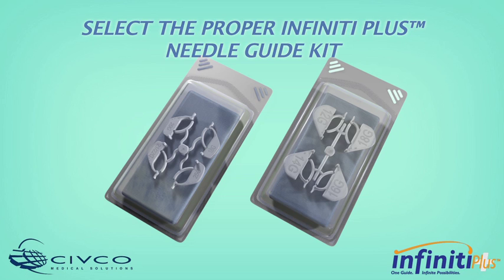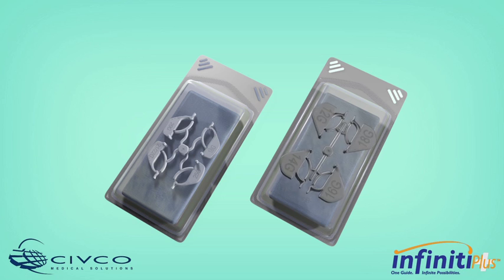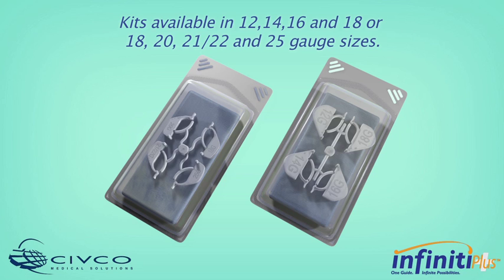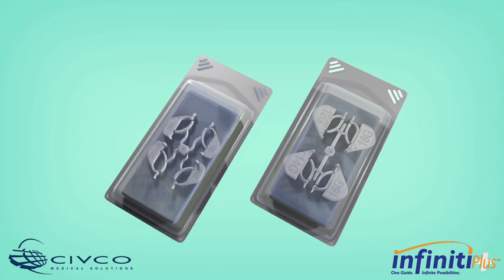Based on the type of puncture procedure, select the appropriate gauge size procedure kit. Larger gauge kits include 12, 14, 16, and 18. Or smaller gauge size kits include 18, 20, 21, 22, and 25 gauge kits are available.